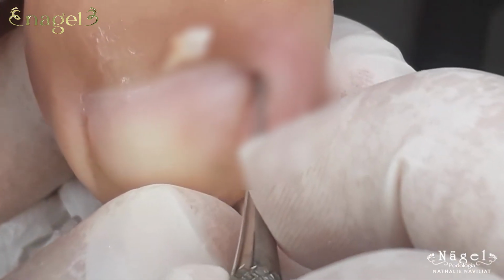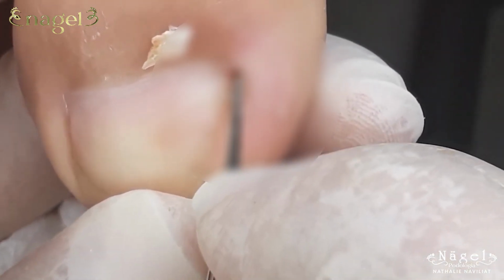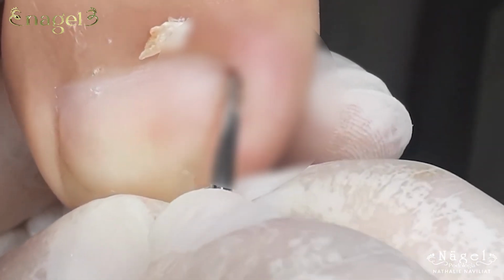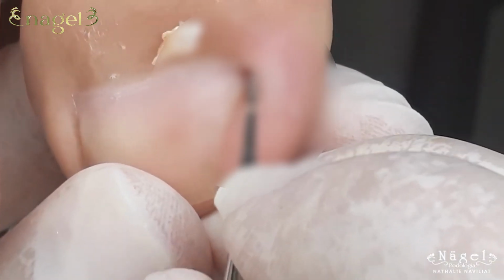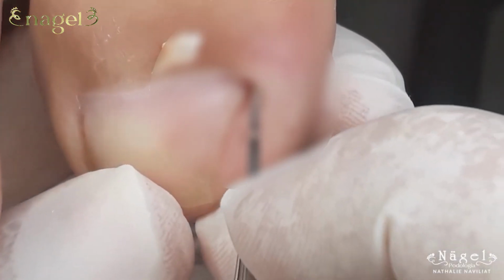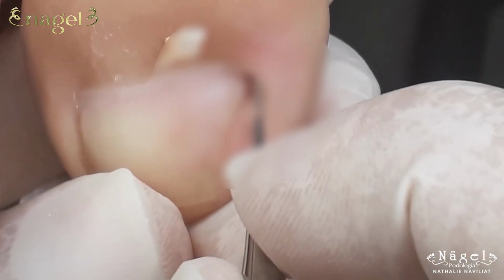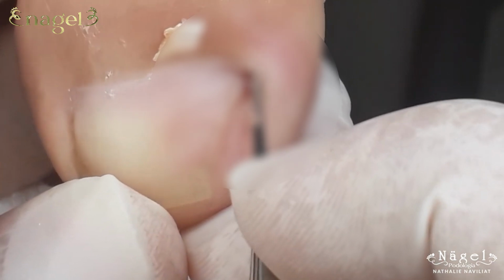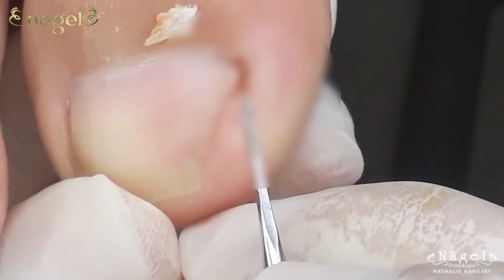Using the tweezers, I gently locate the spur, which is loose inside the skin. I was able to use the tweezers because it's loose in there and the skin didn't come with it. I tell my patient, that's a relief, because not every case allows for such an easy removal. With steady hands, I remove the spur, making sure no fragments are left behind. The area looks clean, with no bleeding or trauma. Thank goodness there's no blood, not even a drop, I say, and my patient looks relieved.